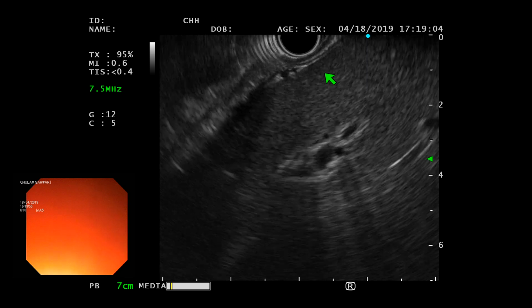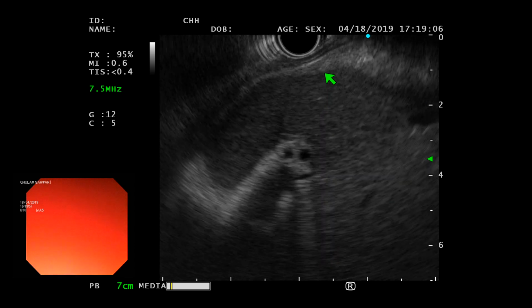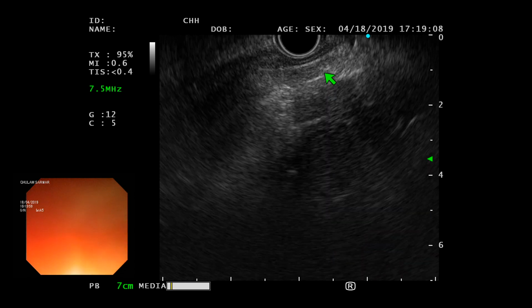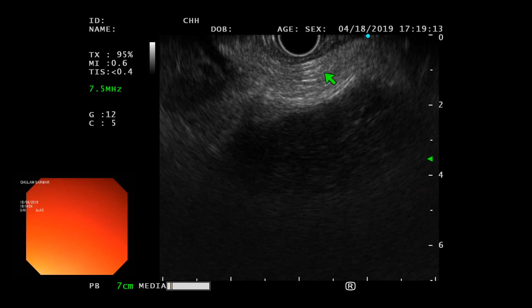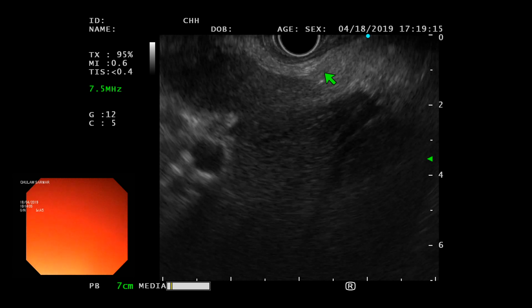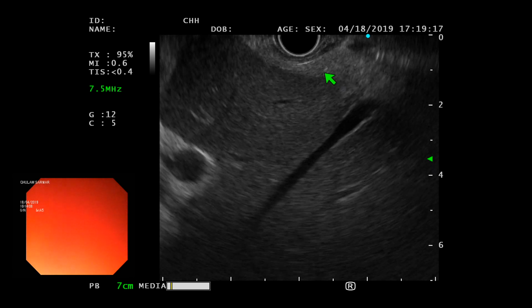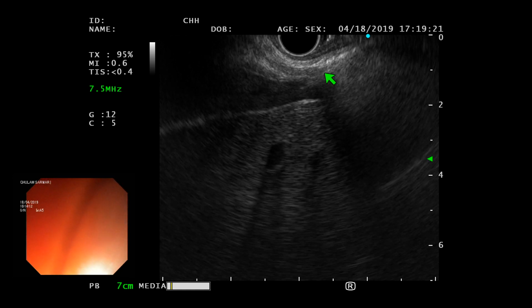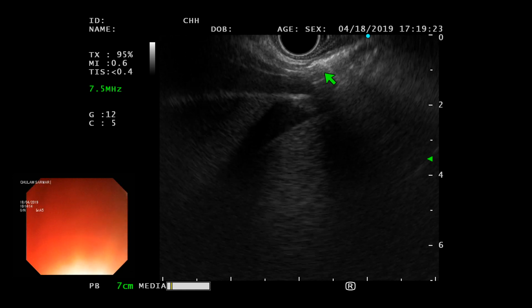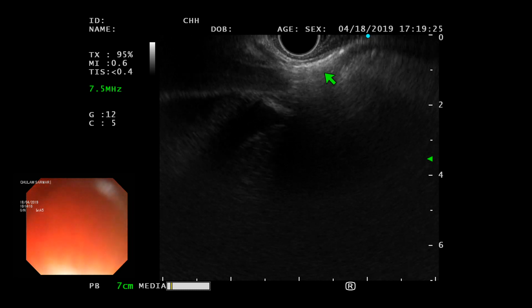So pull the scope back a little bit, so that the liver goes to the left side. Big wheel towards you. Keep rotating to the right. Good. Now you see the IVC in there. Keep rotating further. You see the IVC right there? Yes, we can see the IVC, and that's going into the right atrium.